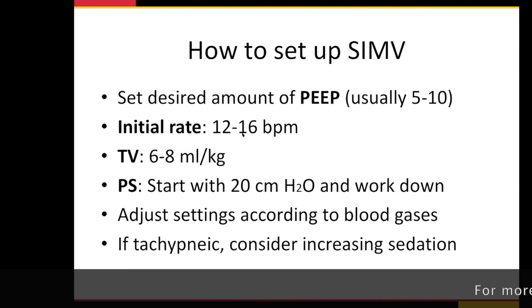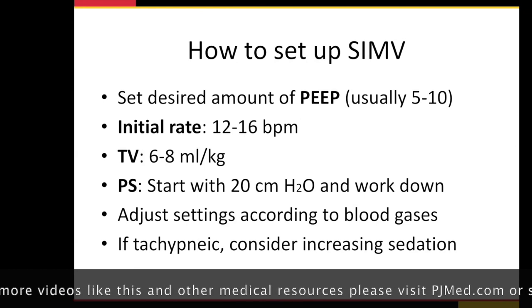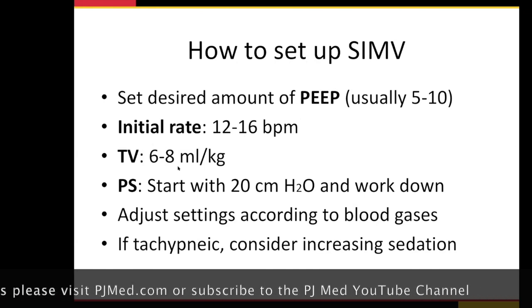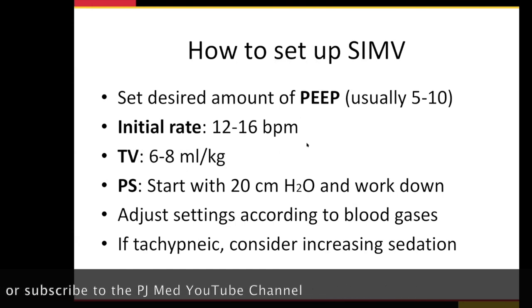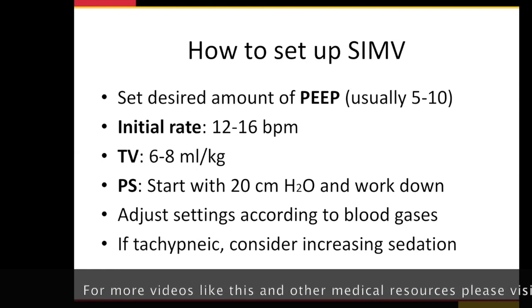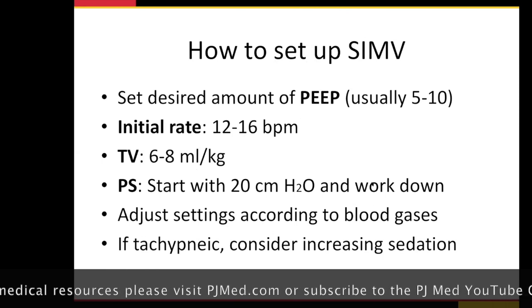Put your rate in. Our usual respiratory rate is around 12 to 16. You adjust it based off of acid base and end tidal CO2. I'm going to show you a way to do that in just a minute. Tidal volume, like we talked about, based on their height, predicted body weight. And then your pressure support breath, program in like 20 centimeters of water and work your way down, see how their lungs are. If their lungs are starting to recover, they're not going to need a lot of pressure to open up. You can just give them the supported breaths in between, okay?